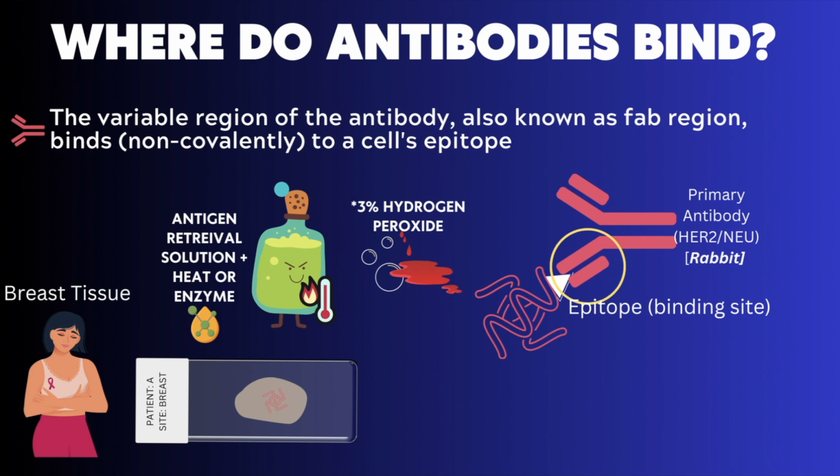I'm a visual learner and thought it would be best to explain what is happening with an illustration. In this example, we will be looking for the protein human epidermal growth factor receptor 2, or HER2-neu protein, which can be expressed on the surface of breast cancer cells as well as on the surface of gastric carcinomas. HER2 testing performed via ISH and IHC still remain excellent predictors of responsiveness to HER2-targeted treatments in breast cancers. We will go over a specific patient example in the next slide.